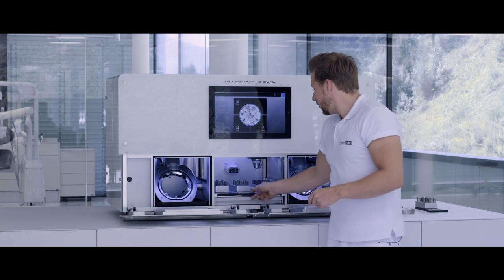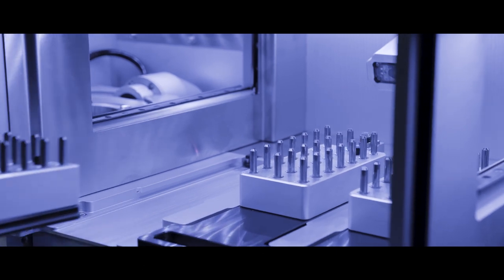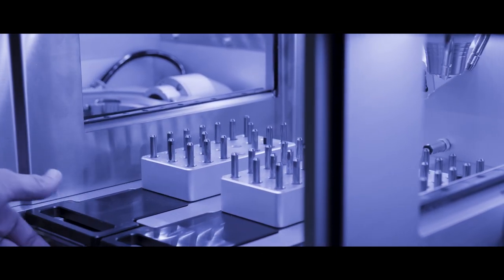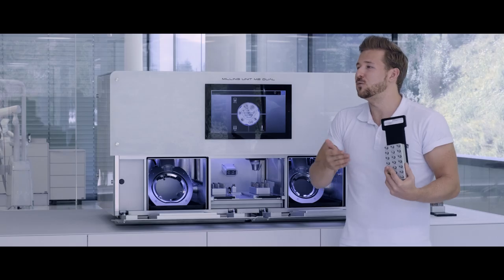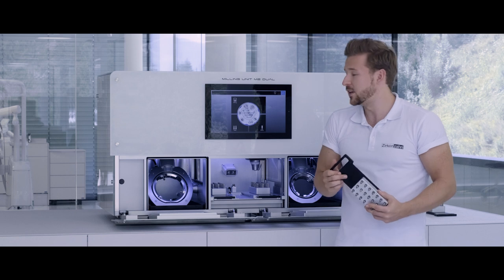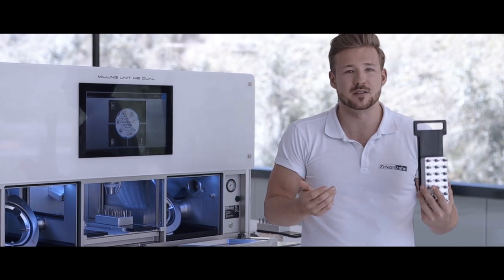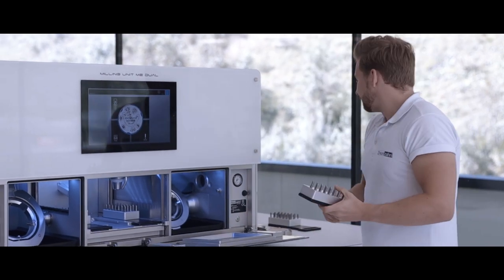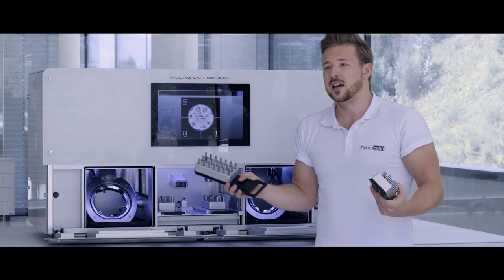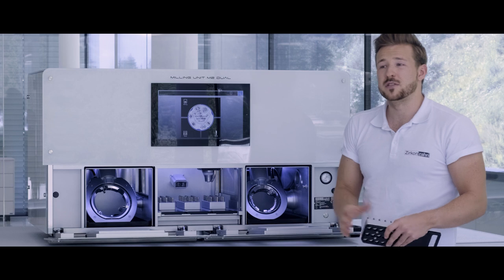You also see three removable tool plates, each with 21 tool slots, resulting in 63 burrs total. When you equip the milling machine with all 63 burrs, you can mill every material we offer — from zirconia to metal — without changing a single burr. You can also add and create virtual milling sets or tool plates in our milling software. If you want, you can order another tool set, equip it, and swap it in. Your M2 always has spare burrs to hand.